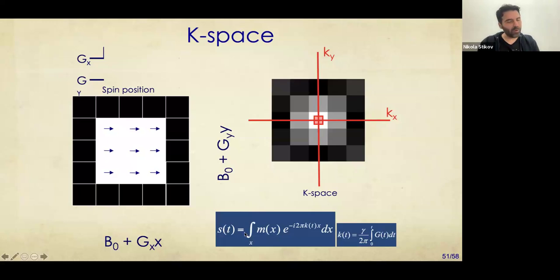Because until now, probably the only thing you've done with Fourier transforms, you say, I have time and I want to move to frequency. Except what if your frequency is actually a function of the gradient, which is actually a function of the time? And in the end, everything gets written down as a function of time, even though you're taking the Fourier transform of a spatial variation. So it's really involved, it's really complex.